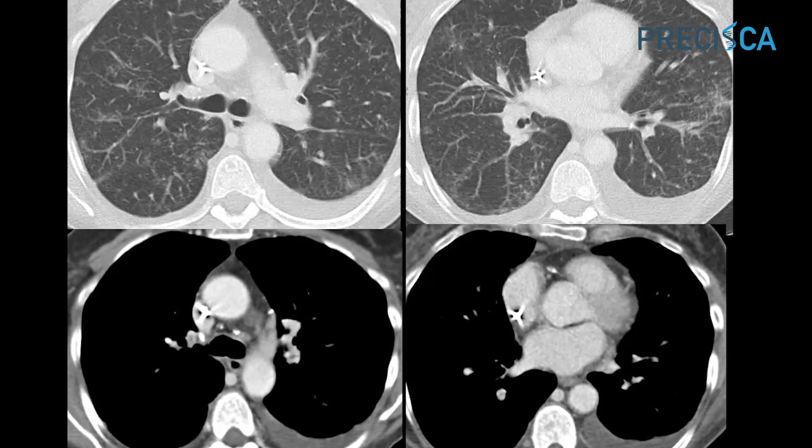But I do want to draw the attention to this finding because this finding is kind of subtle and sometimes easily overlooked, because you don't see the discrete nodules that we think of with metastatic disease, nor do you see those macroscopic filling defects as we saw with those first two cases that are a little bit more obvious.